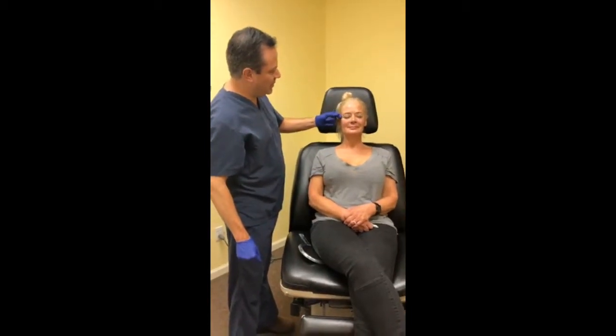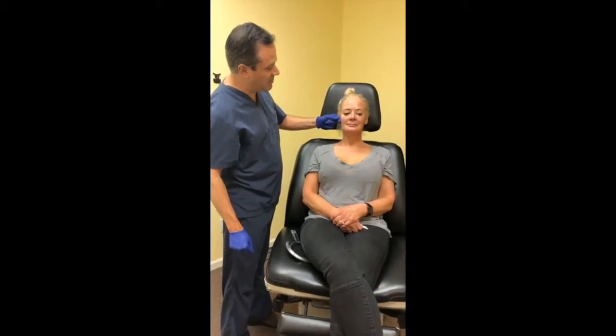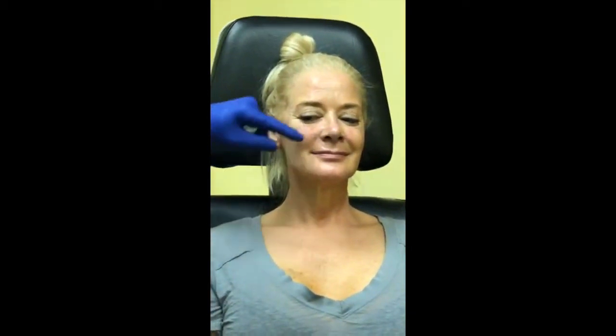We're going to do a little bit of filling in the temples to soften the cheekbones, a little bit of filling below the cheekbone to soften it. She's got great cheekbones but the area looks a little too hard and bony, so we're going to soften that and build up the cheeks and upper area. We're also going to soften the nasolabial folds, the jowl line, and possibly firm up the jaw a little. Let's get started on the temples.